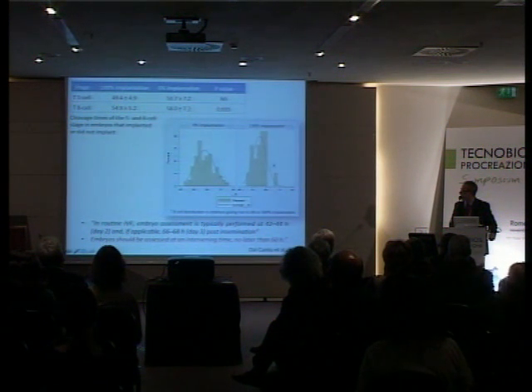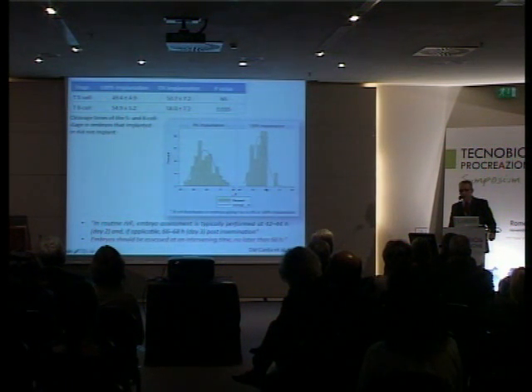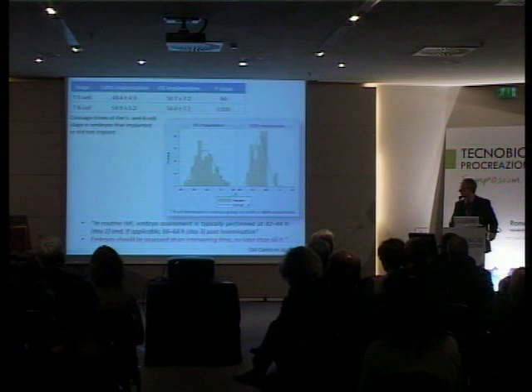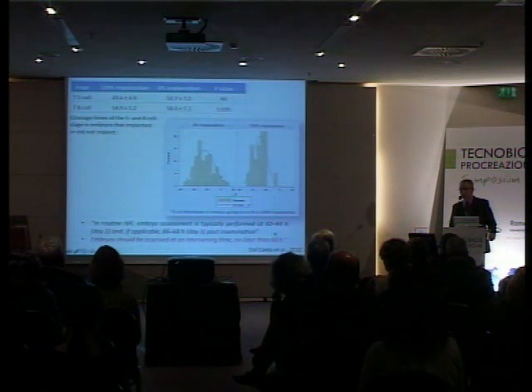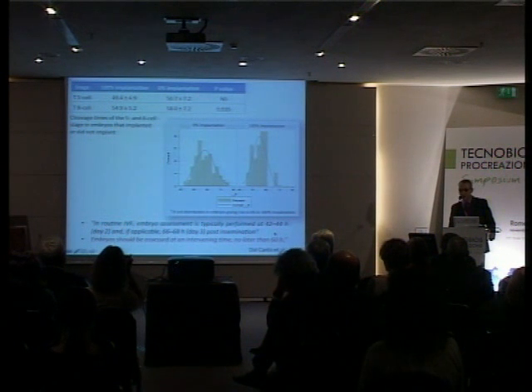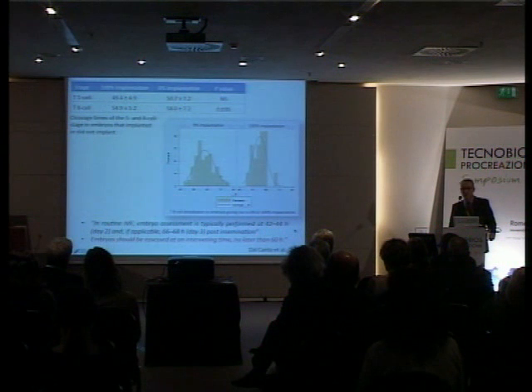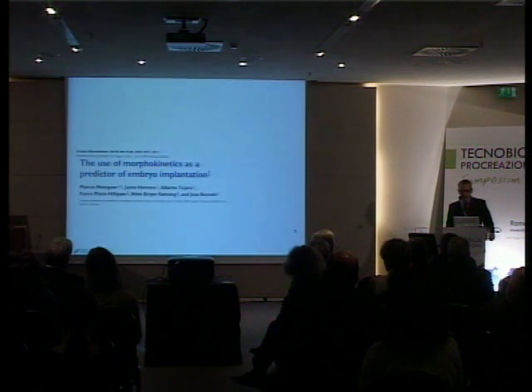And the perhaps more interesting thing is that when you have implantation, you rarely see that embryo develops to the 8-cell stage beyond the 60 hours, which is at the middle of the night, well, 2 or 3 hours after midnight, usually. So perhaps we should rethink either the observation time, which is a little bit difficult for embryologists again, or perhaps reconsider the entire time schedule of an IVF cycle.